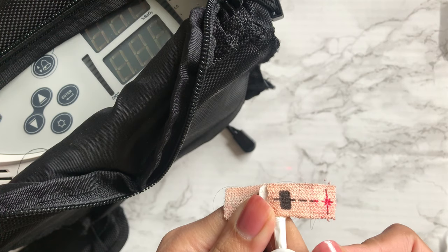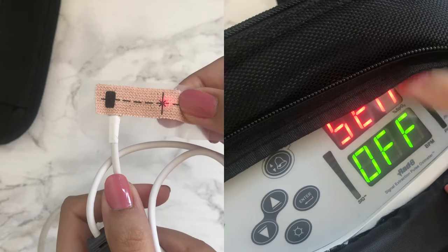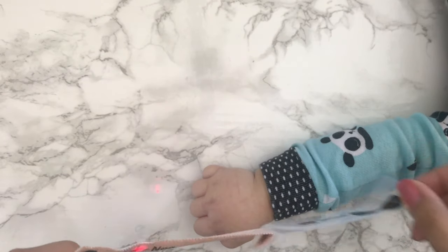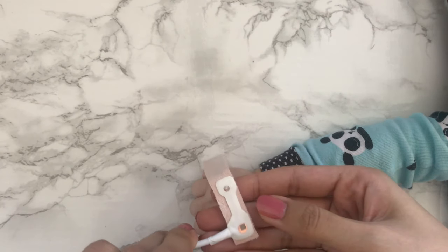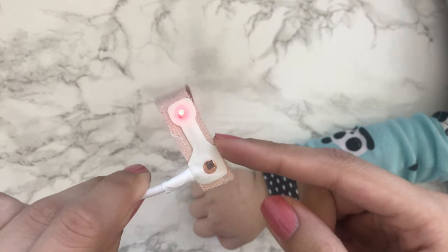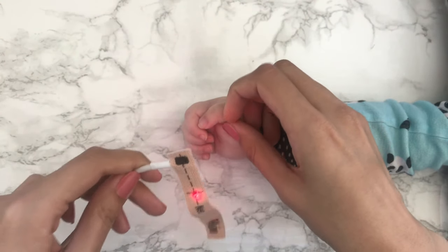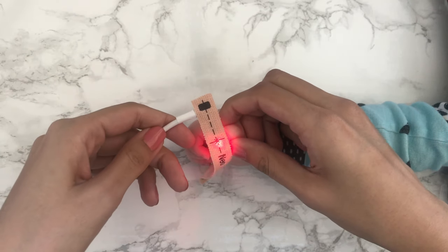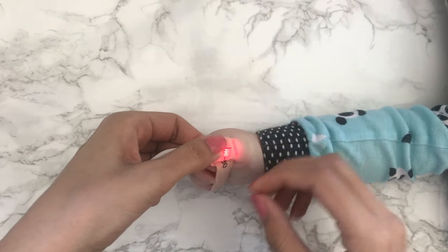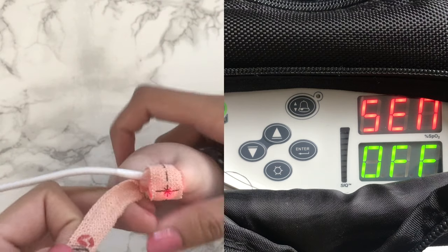Once the red light switches on the probe, you're good to go. The interface will show 'sensor off,' which means it's not picking up a signal. Now we're ready to place the probe. Peel off the backing of the probe. I use either a thumb or the big toe for best readings. There are two sensors on the probe — they pick up oxygen levels by passing light through the blood. It's completely painless. Place the blinking red light over the nail and wrap the rest of the sticker around it. The sensors should be directly opposite each other to pick up signals adequately.